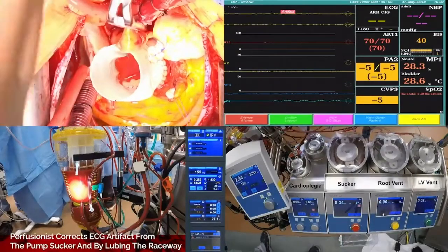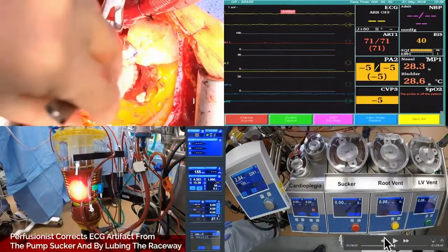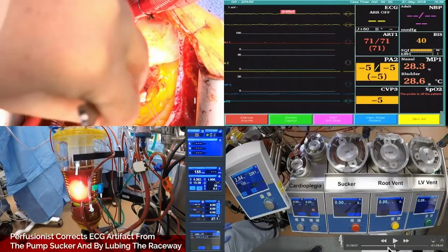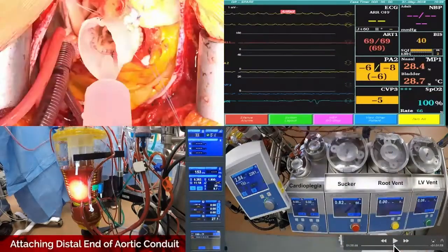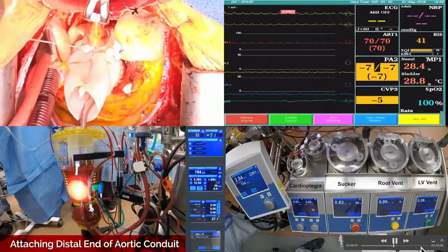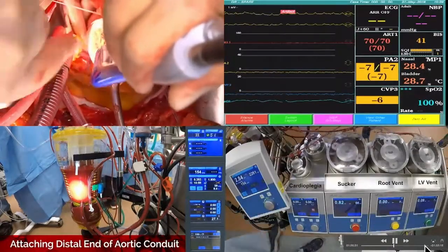Can you go back 20 seconds and play? I'll tell you what the most impressive part of that was. I didn't even know that was going on. Right. I mean, he did it when I was using the cell saver sucker in there. Did you notice that? Yes. Well, because this pump sucker stops working and you switch to it. You just go back like 20 seconds. Now watch that pump head. You'll see it bounce up, and when it jams.